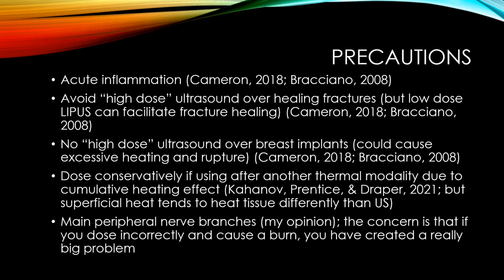You want to avoid high-dose ultrasound over breast implants because you could cause excessive heating of the contents of the breast implant and rupture it. That would be bad. You also want to dose conservatively if you're using therapeutic ultrasound after another thermal modality because of the cumulative heating effect.